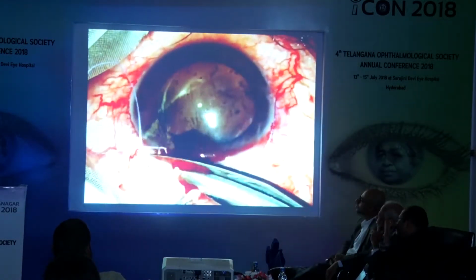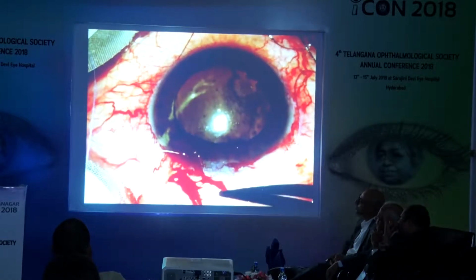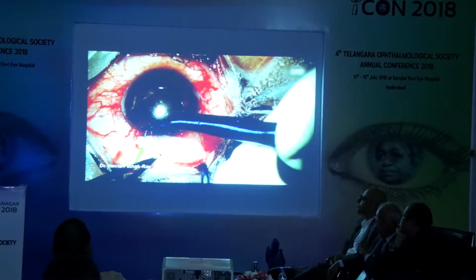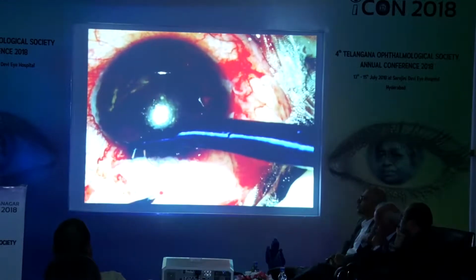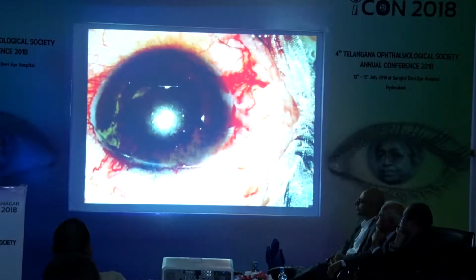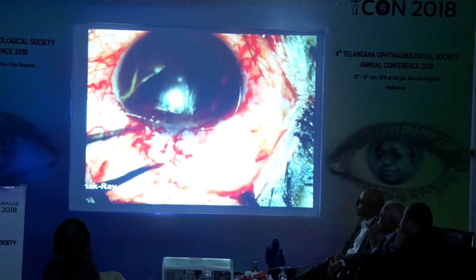superiorly at the limbus. To our surprise and dismay, no scleral flap was seen. Instead, 4 full thickness fistulae were visible in the exposed scleral bed. These were promptly sutured with 10-0 nylon interrupted sutures.